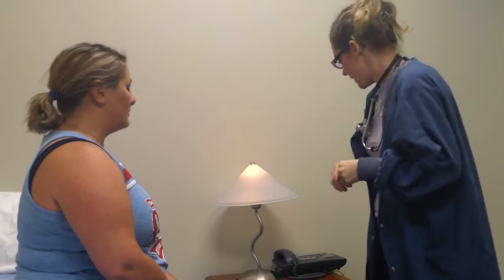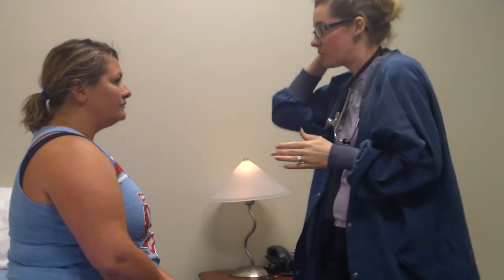I can see the bones, which are the umbo, the malleus, the pars tensa, and the pars flaccida. I can see the cone of light. It's at 5 o'clock in the right ear and 7 o'clock in the left ear. Now I am going to do a whisper test. I want you to go ahead and cover your ear, and I'm going to whisper something in your ear.